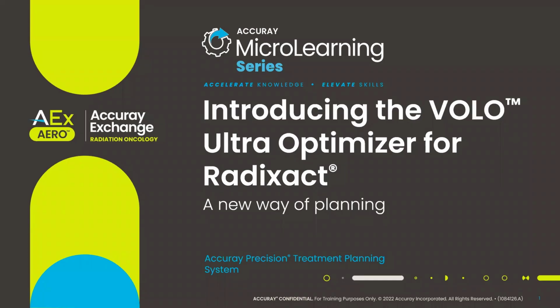Hello, I'm Julie Holt, and I'm with the clinical applications team here at Accuray. I'd like to welcome you all to today's session, where we'll be introducing our new VOLO Ultra optimizer for our Radixact and TomoTherapy systems. This course is designed for those who are currently familiar with planning on tomotherapy, and also planners who are just curious about planning on a tomo and what it might involve.